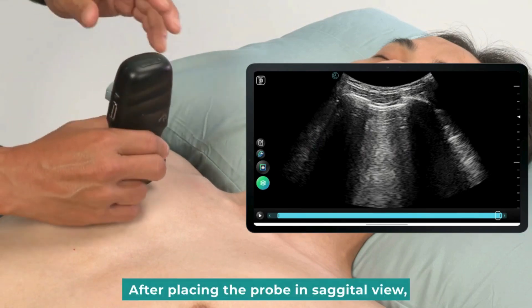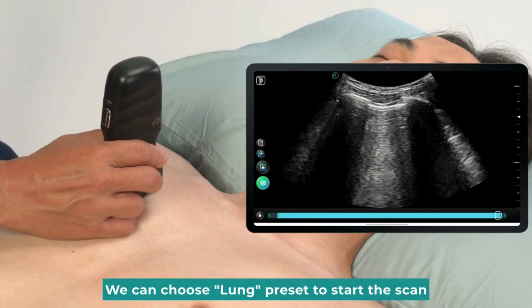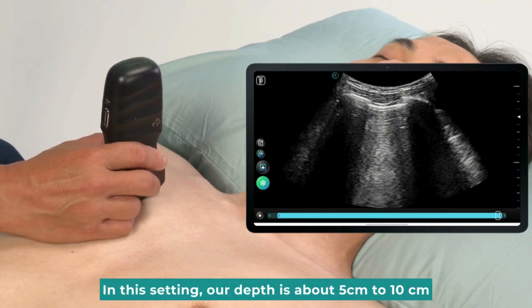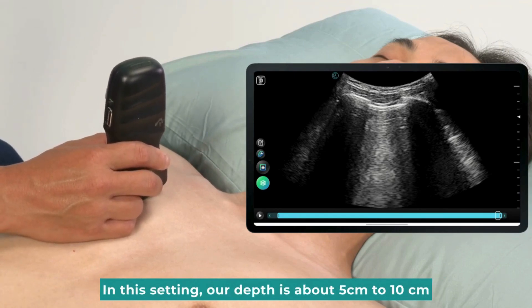After placing the probe in sagittal view, we can choose the Lung preset to start the scan, depending on the size of the patient's body shape. In this setting, our depth is about 5 cm to 10 cm.